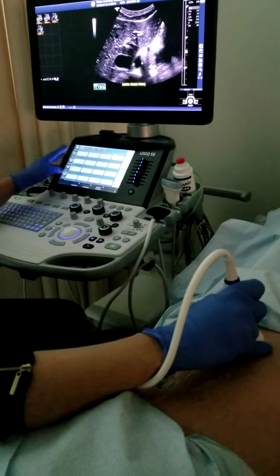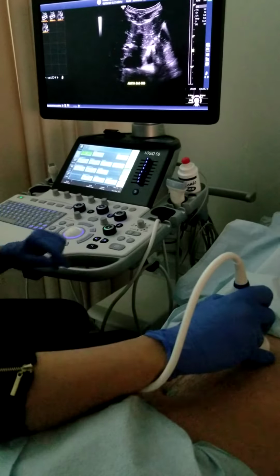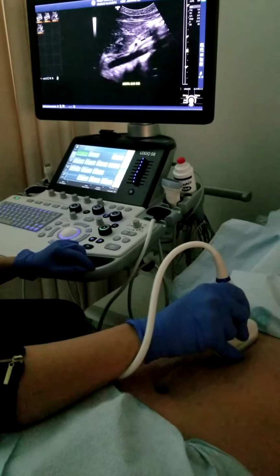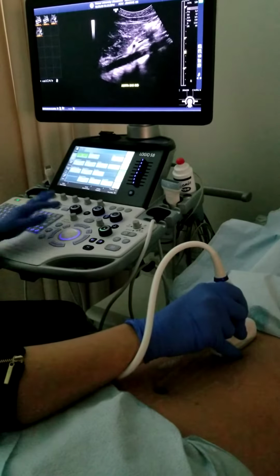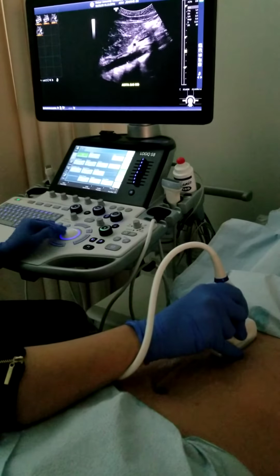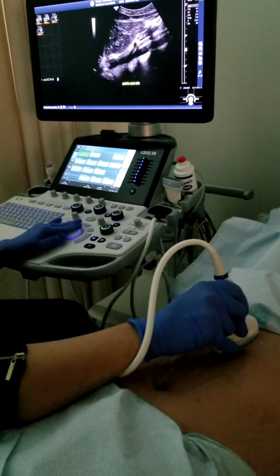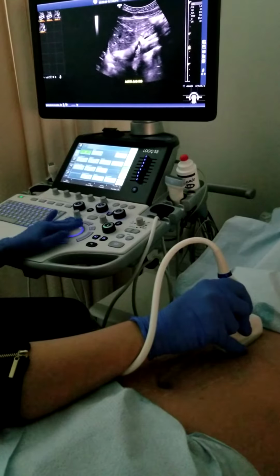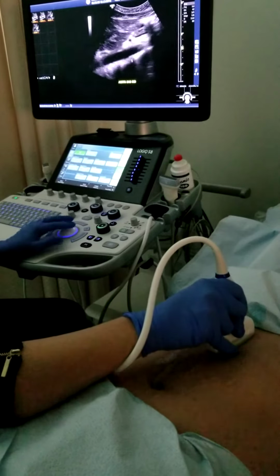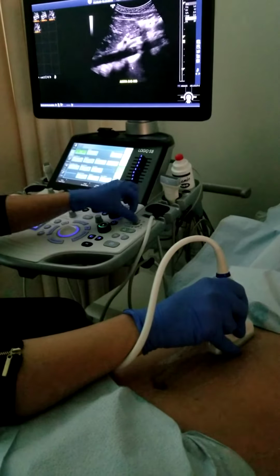Okay, my next image is going to be sag mid. Same spot, I'm going to turn my indicator up again towards my patient's head, find my aorta. Now I'm going to look for my anatomy. Again, here's left lobe of the liver, here's my aorta, here's my first branch, and here's my second branch. My first branch is my celiac axis, my second branch is my SMA. So I'm going to scan a little more inferior, change my focus and my depth.